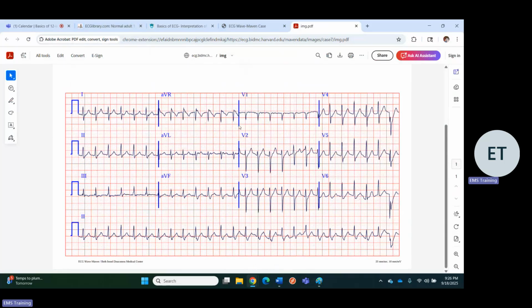My gut tells me it's not sinus. It's either an abnormally regular AFib, but I don't know about that. I mean, the faster an AFib goes, the more regular it does appear. You can't have an AFib of like 190 to 220 and really expect to see much variance between the R to R.